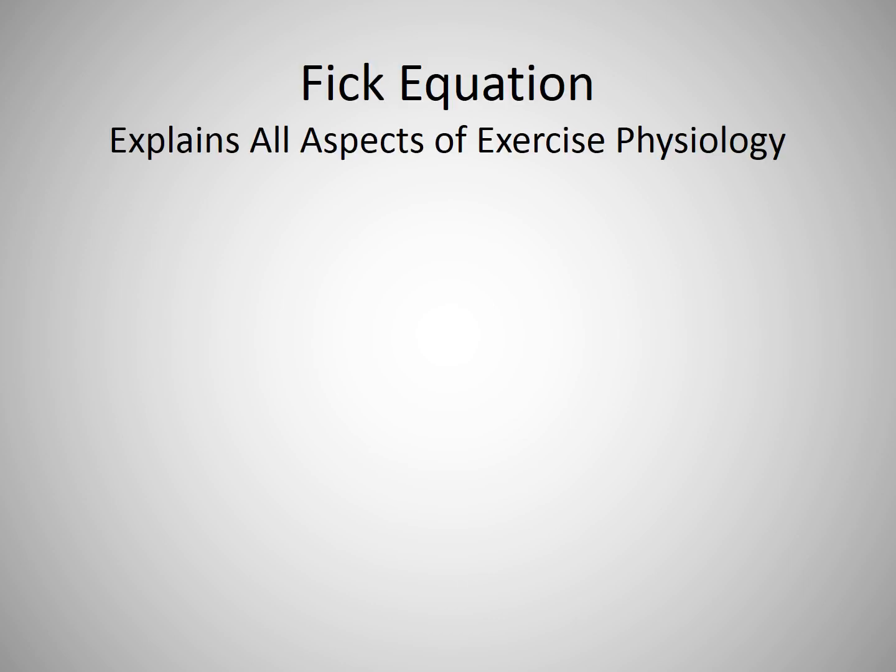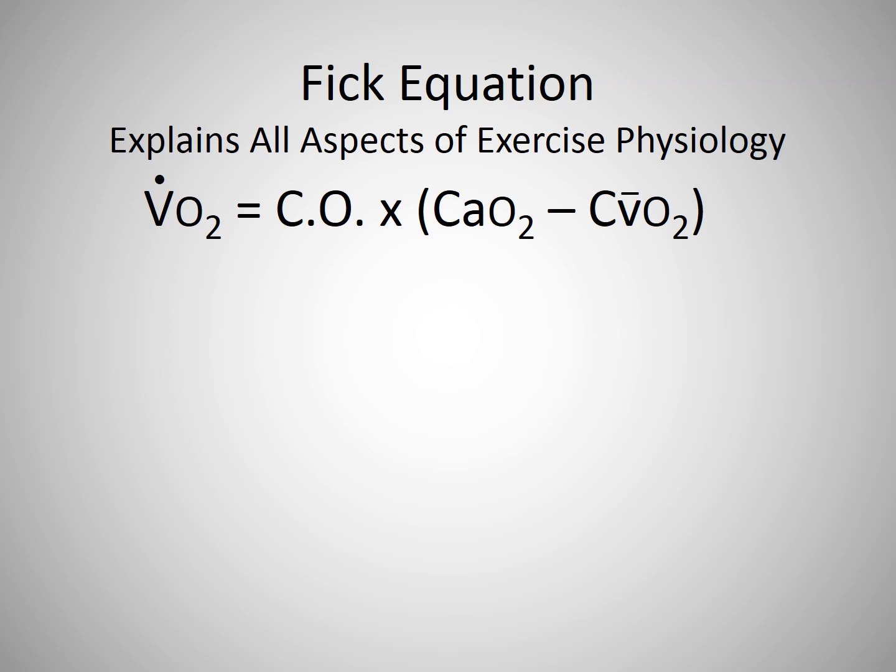Examining the patterns of the tracings for the cardiac parameters can be just as useful as when we examine the graphs for the respiratory patterns. Remember how we said we can explain all aspects of exercise physiology by the Fick equation, and we showed how the cardiac output equals the heart rate times the stroke volume?